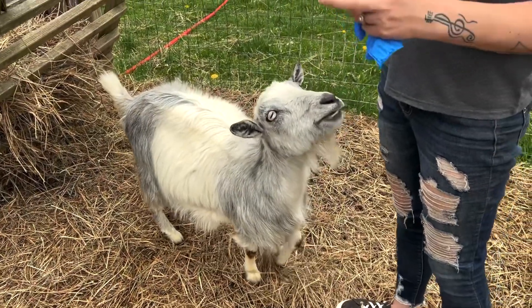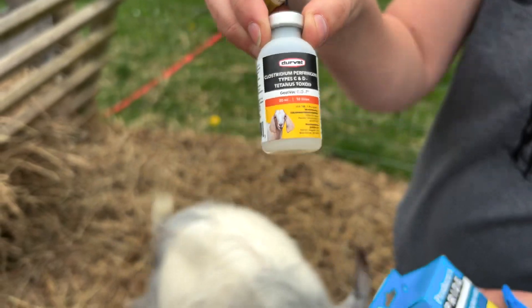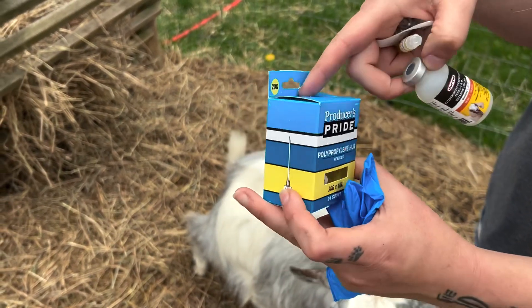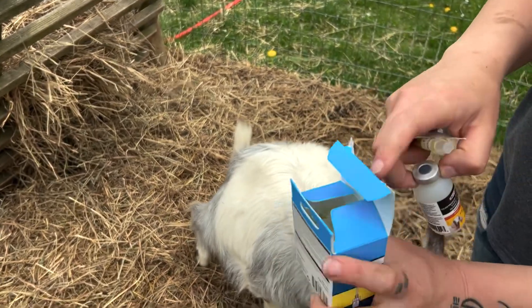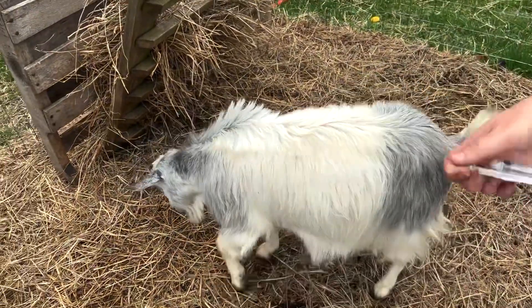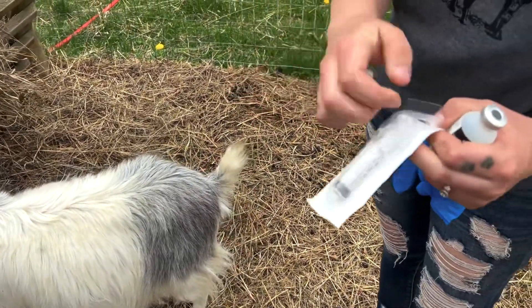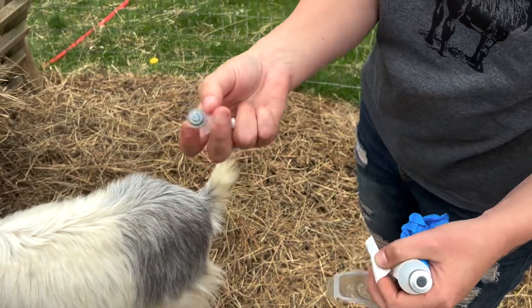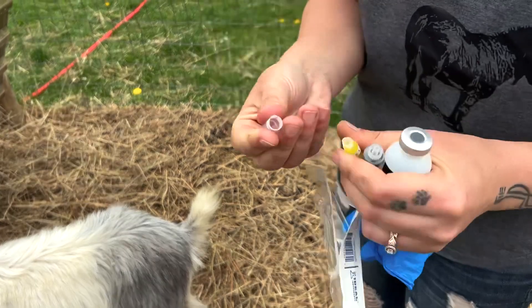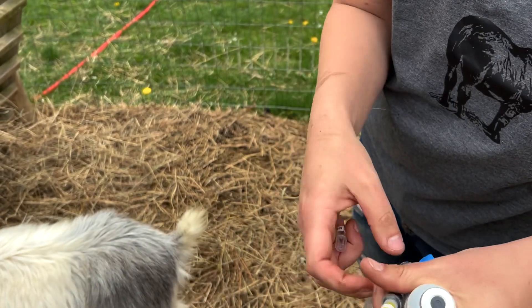So we're going to do our adult vaccines now. It's that same CDT vaccine. For the adults, I'm going to use the 20 gauge one inch. There are a ton of needles in this pack. Again, you can use the same syringe for everybody if it's the same vaccine, but you want a different needle every time — they just screw on the tops of these. Take off the bottom cap and it screws right on to the top.